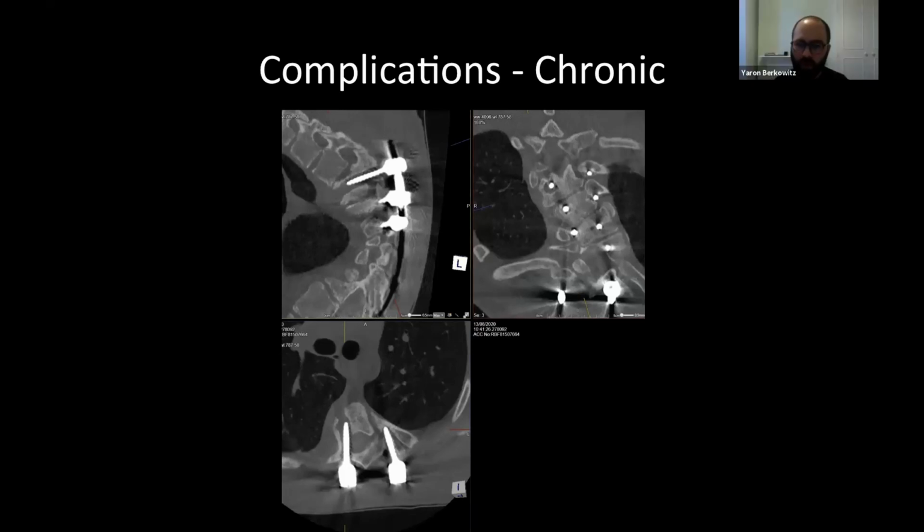So we did an MRI on this case, which basically wasn't enormously helpful. It showed that this area here was a heterogeneous fluid signal. So CSF pulsation artifact was still one consideration. But the other was that it could have been granulation tissue. And the patient had revision of their metalwork, but they were due to have the metalwork out at some point. So they didn't do histological sampling at that stage, but it wasn't infection. Okay, thank you, great.